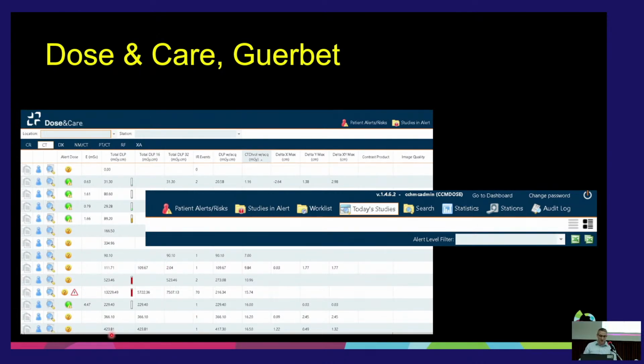And I'm going to drill down and show you some of the features on it. But you can see just real briefly, you can click on any one of these patient exams and it gives you all the specific details. It'll tell you green that everything's fine. It'll also give you kind of this thermometer right here. Even though it was a pass and everything was fine, it'll tell you with respect to what a normal exposure would be for this type of exam.